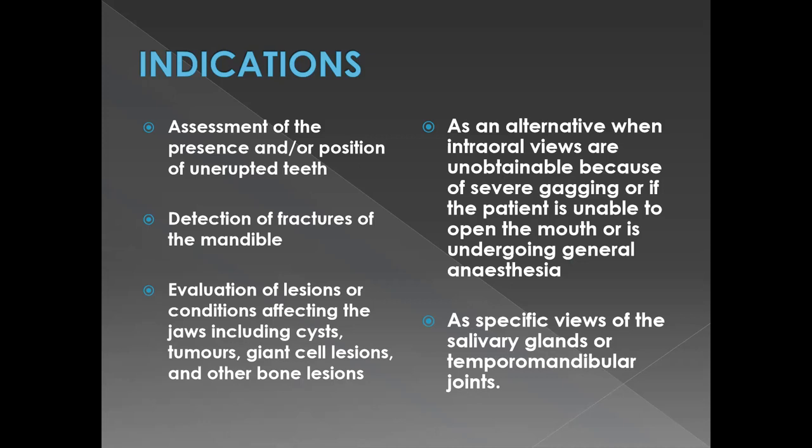It is also an alternative to an OPG when you can't take intraoral views, because either the patient has a severe gag reflex, or the patient is unable to open his mouth, or the patient is undergoing general anesthesia. I'm sure all of you know that an OPG is done when the patient is in a standing position. Whenever you're operating, obviously the patient is lying down, so you can't do an OPG. There's no modification to the machine, at least to my knowledge, that would enable you to take an OPG while they're under general anesthesia.